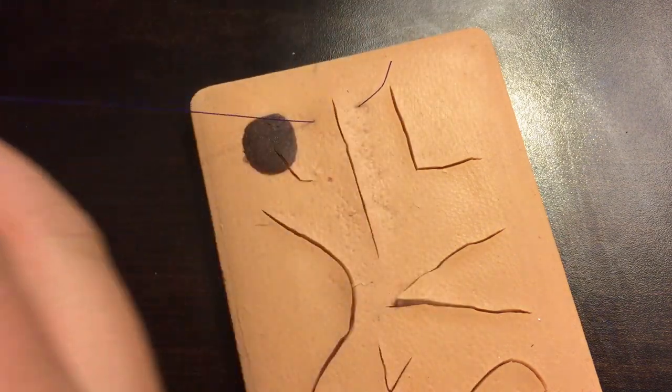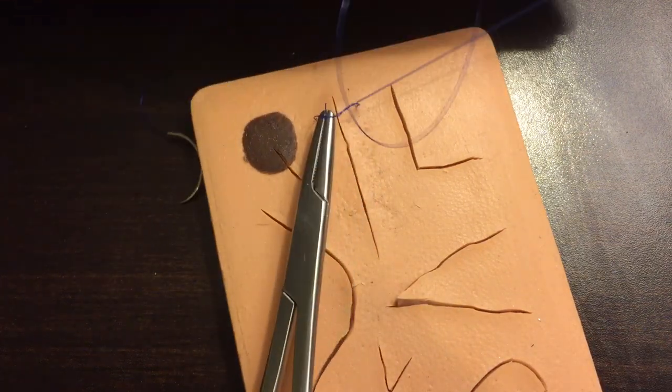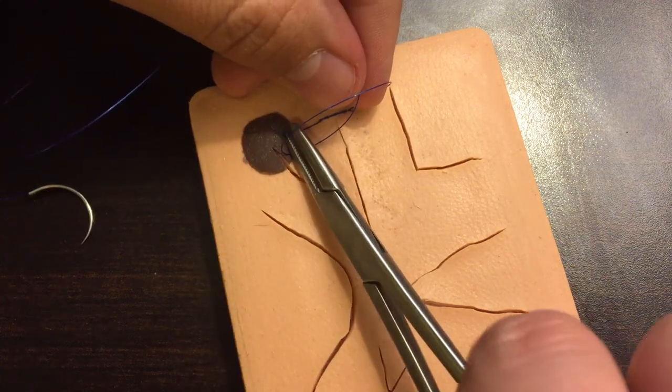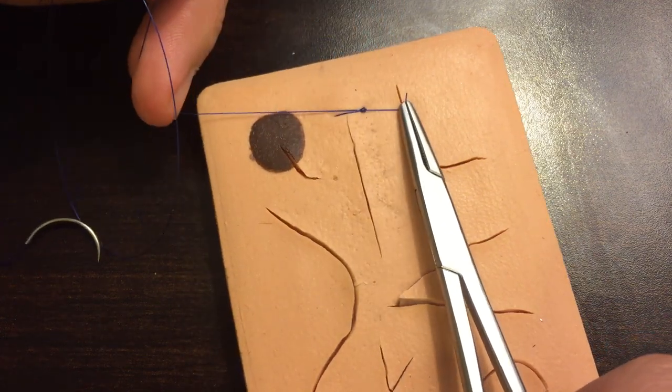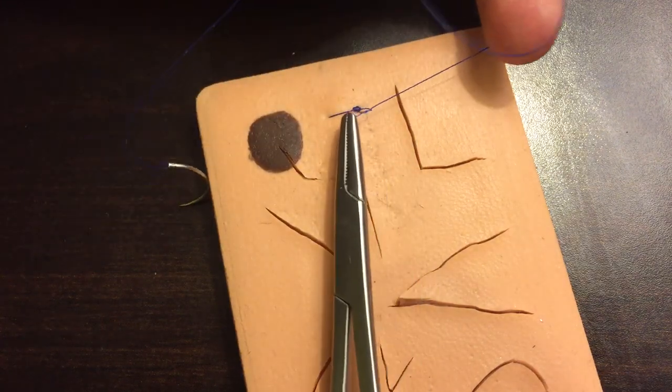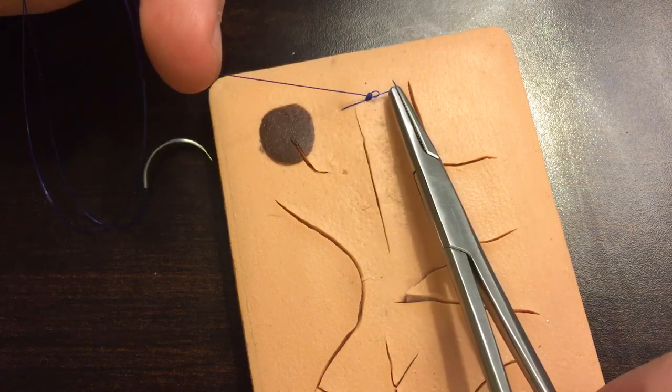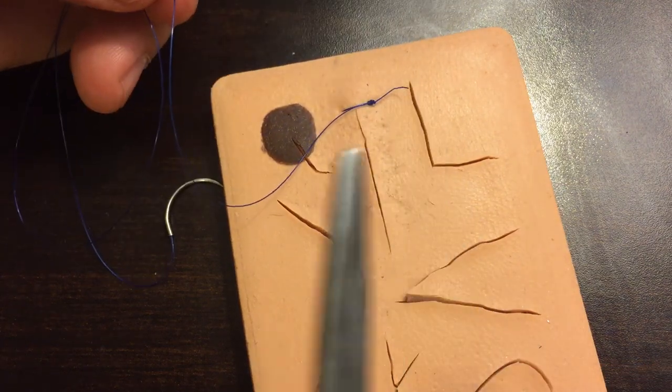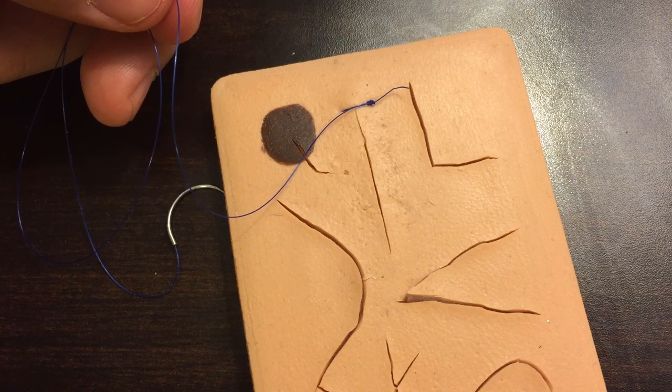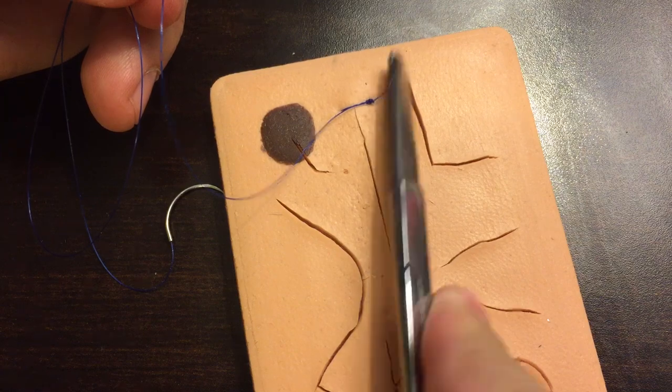So this type of a running suture can be very nice and handy actually for some simple, very simple lacerations or incisions that are small. It's not going to work well for large lacerations or jagged lacerations. But if it's a very small, simple laceration, or for example, in the clinic, if you do like a lipoma and remove a lipoma, this can be a very nice little suture at the end of that.